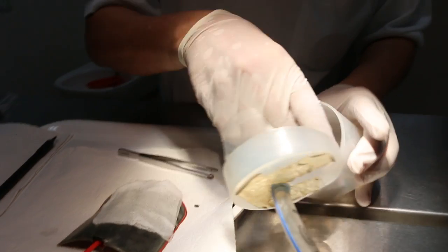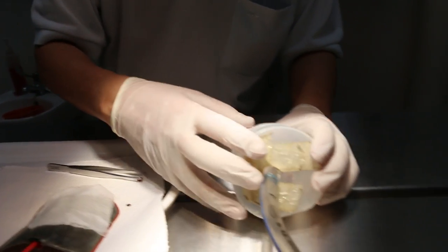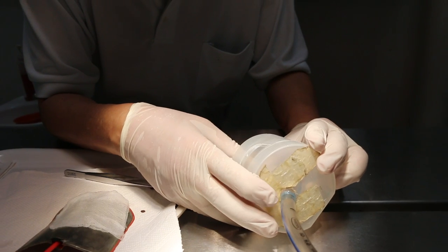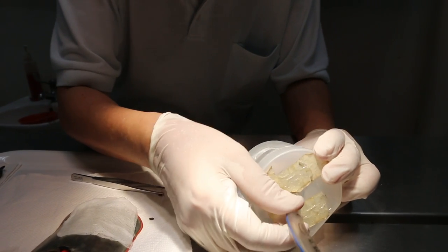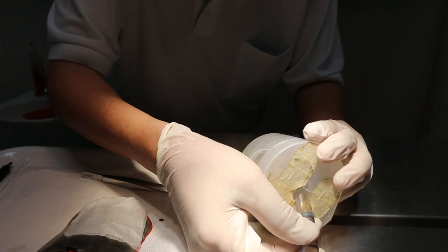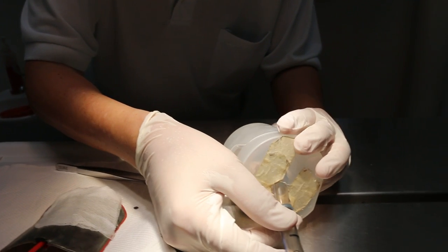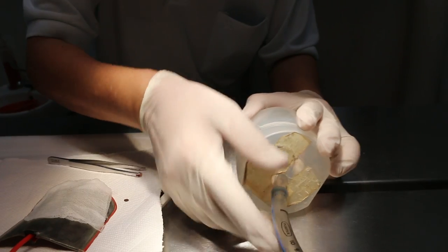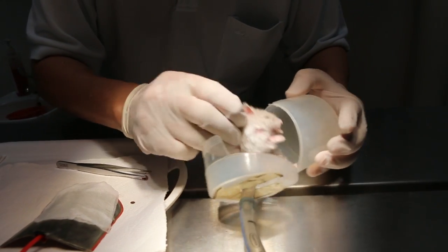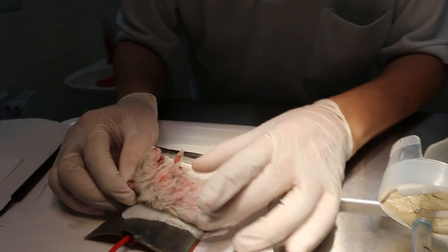So he wakes up again. It's difficult, so back to anaesthetic again. So in hamsters, it's up, in and out, in and out. It's not very satisfactory like dogs or cats. But there's a limit to injections. In this case, I could have given an injection, but the gas is still the safest.